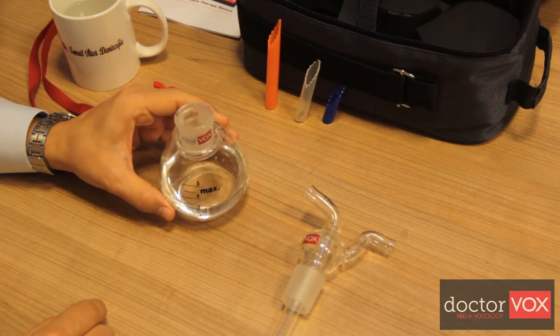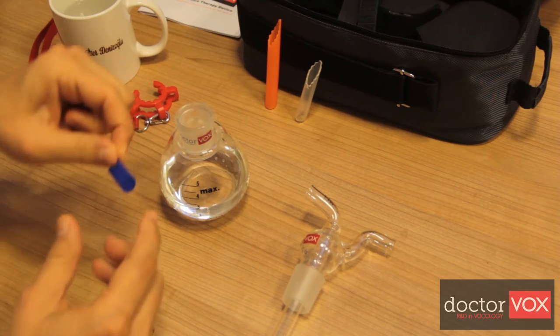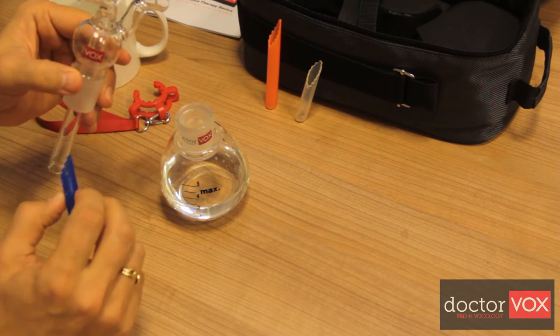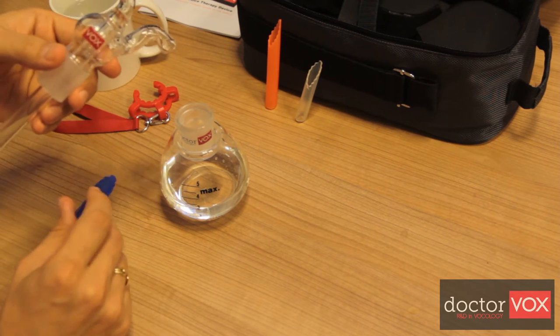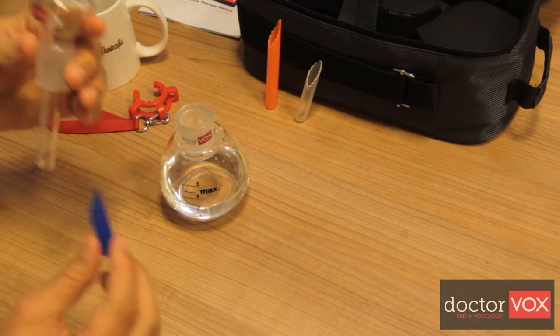An additional specially cut silicone tube, the tip tuner, can be used to increase back pressure up to 15 to 20 cm of water in order to help professional vocalists train at high loudness levels.